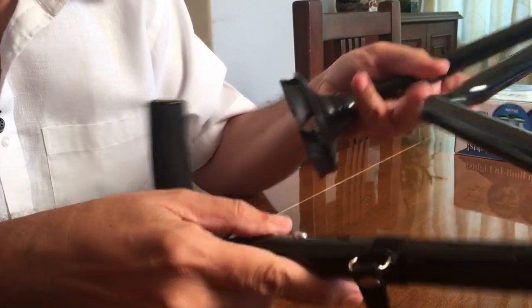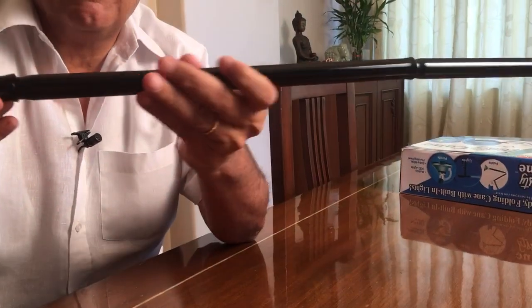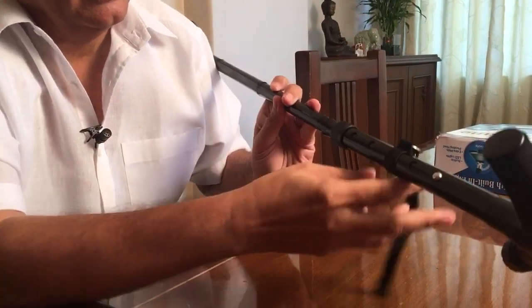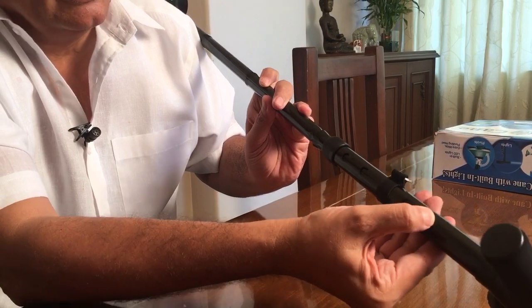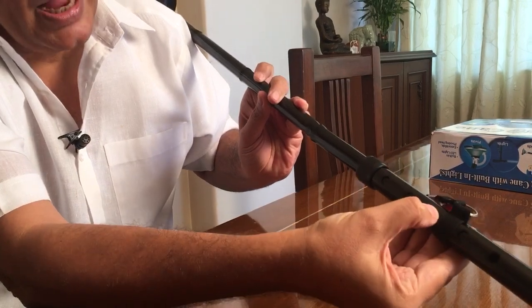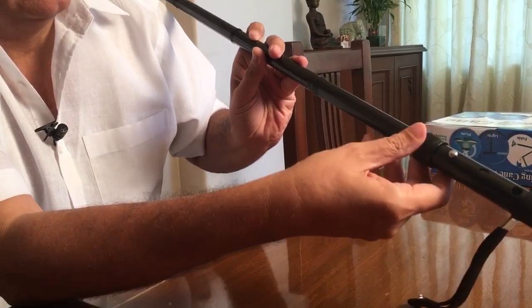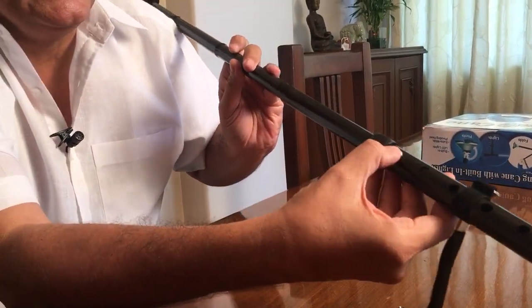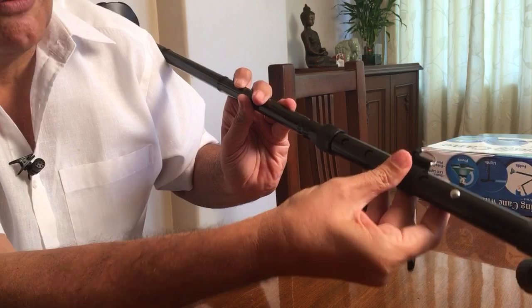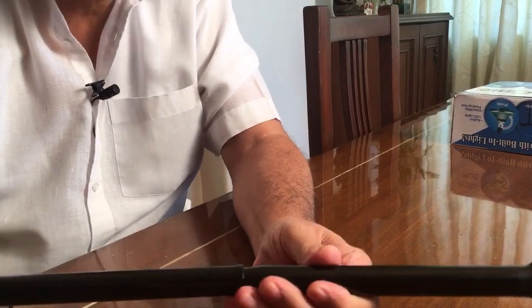Now we'll open the cane and see how it opens out. This is a solid aluminum frame with an extendable handle, so that depending on the height of the person using it, the cane's length can be easily adjusted. That's a very good feature, and once open, it doesn't fold easily.